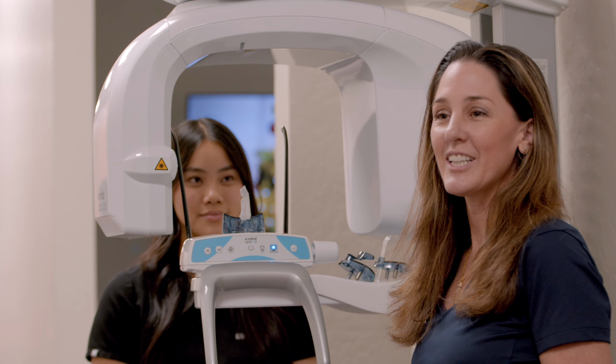Each one of these has additional bite sticks that you slide in, and it's important to note that there's a little notch here. So the anteriors 8 and 9 are going to be right here in this notch. You want to make sure your patient doesn't overbite so that we don't get them out of shot.